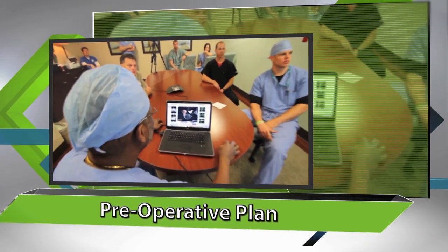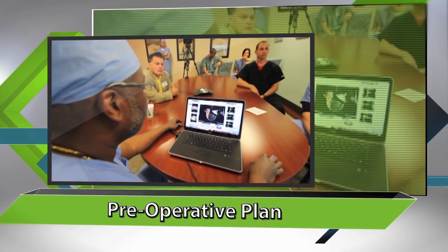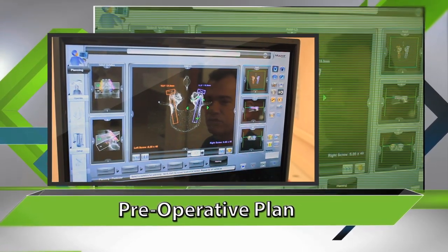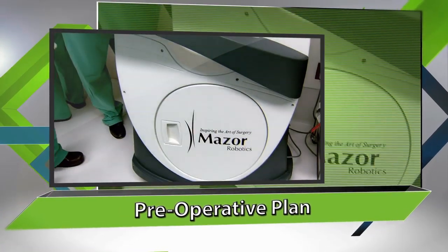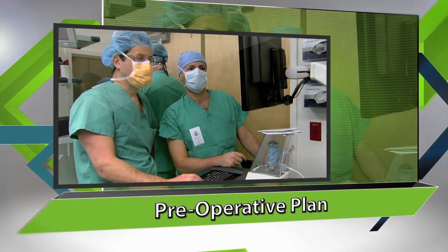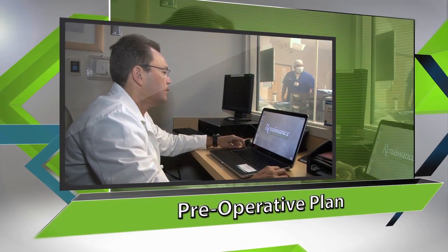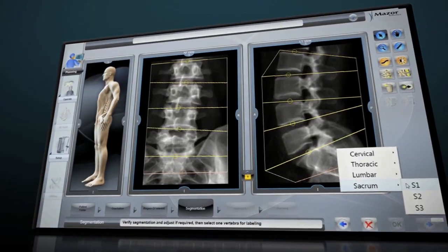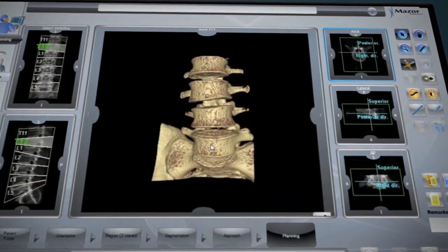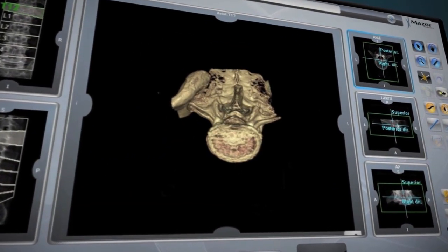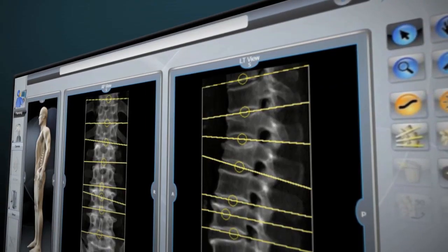A Renaissance procedure starts before entering the operating room by planning the case on Renaissance's proprietary software. This planning may be done on the workstation or conveniently on the surgeon's personal computer. The patient's CT scan is uploaded to Renaissance's advanced software to create a detailed 3D model of the patient's spine.